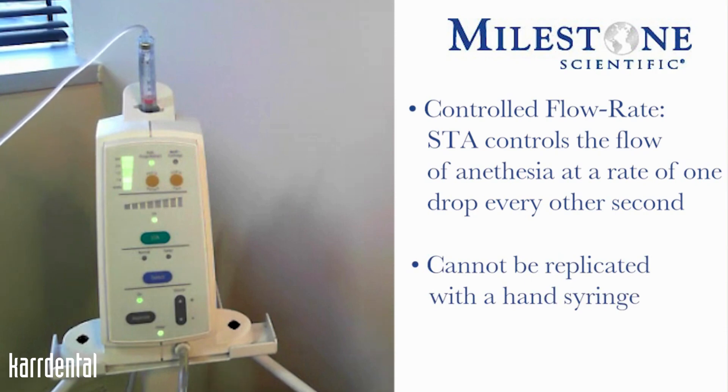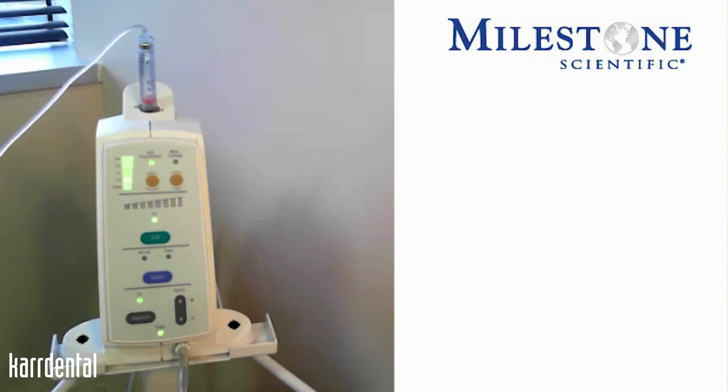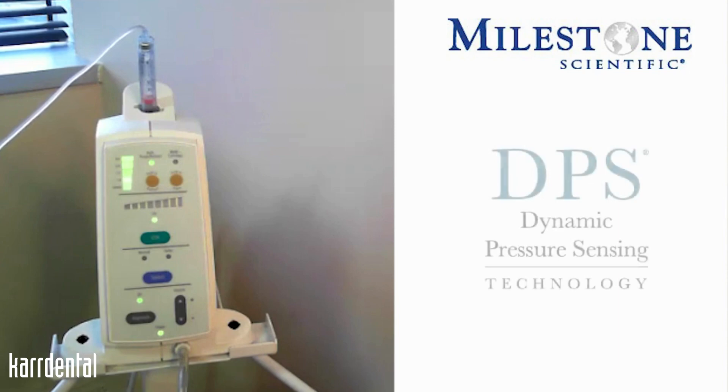With this controlled flow rate, you will do single tooth injections as well as anything on the palate. The instrument itself has dynamic pressure sensing, or DPS.